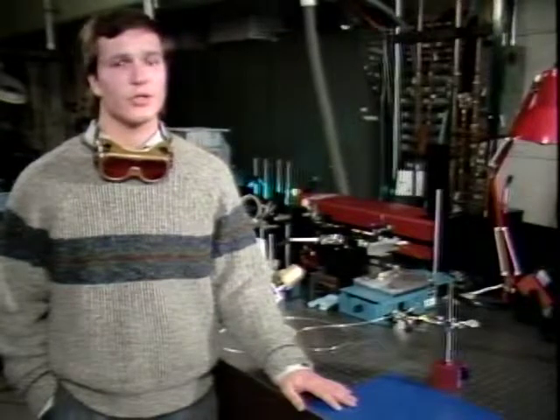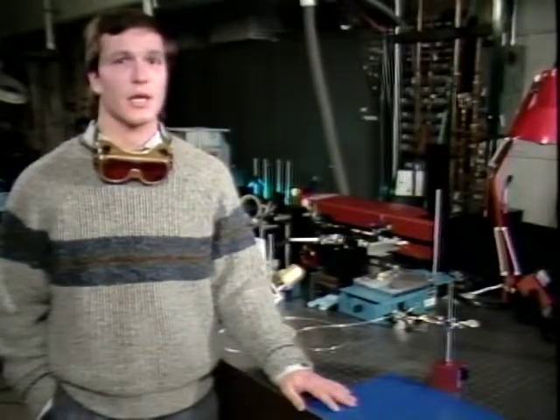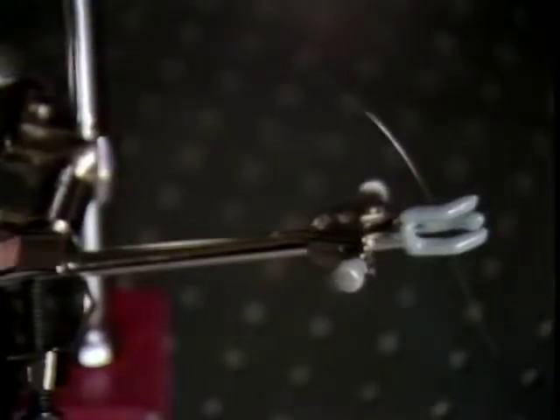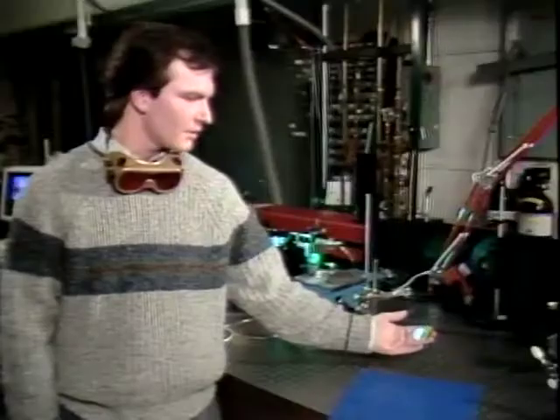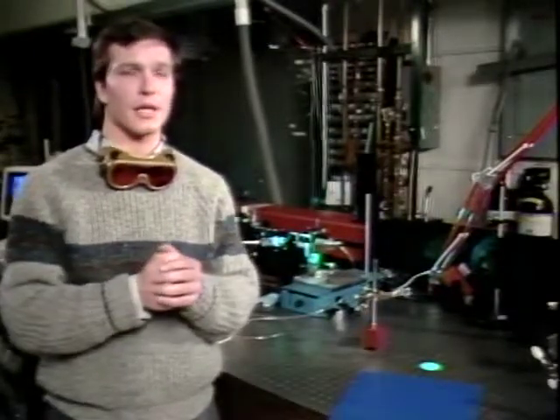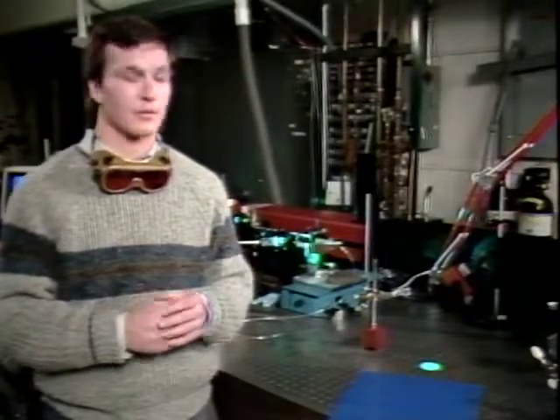We are now going to introduce you to our laser catheter. We want to give you an idea of its components and an overall picture of how it works. We start with a quartz optical fiber. We are now transmitting blue-green light from our argon ion laser. We take many of these optical fibers, bundle them together, and encase them in a transparent protective optical shield. This constitutes the working end of our laser catheter.